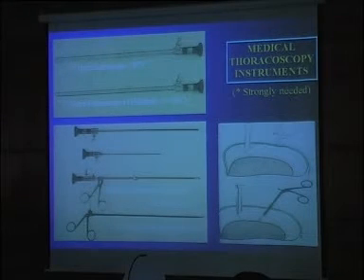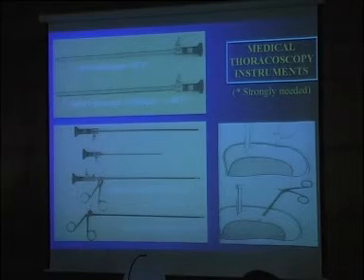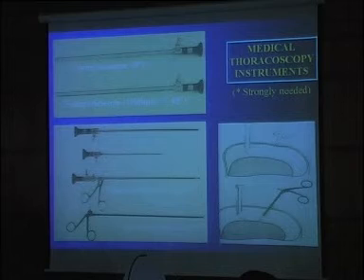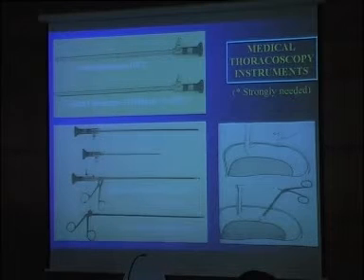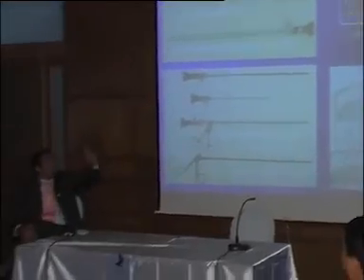So, about the position of the trocar and the telescope, the distance between them and the direction, are they opposite each other? It's under visual control. I know there are two ports. No, one port in this case. One port. You enter with this telescope up here. It's the rigid one. So where can I put the telescope? You put this telescope.